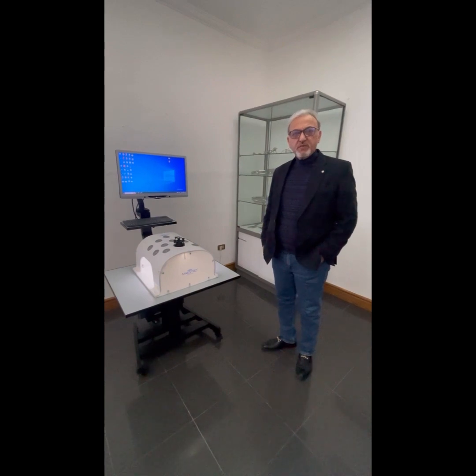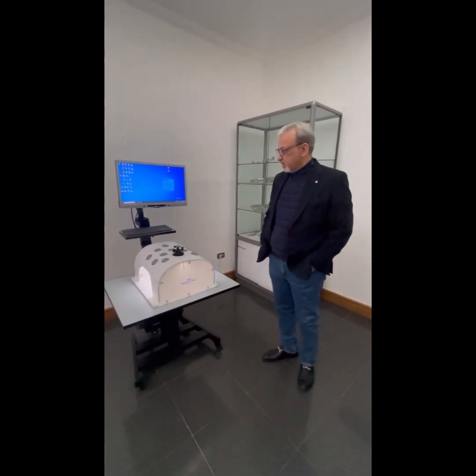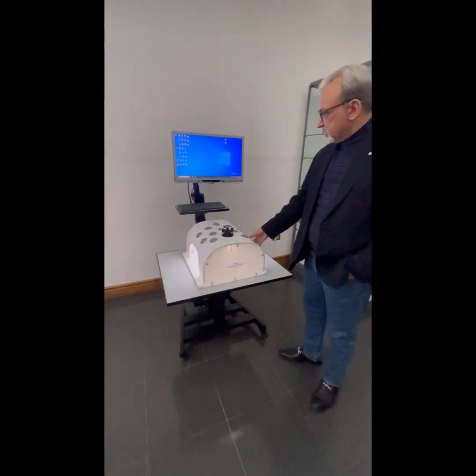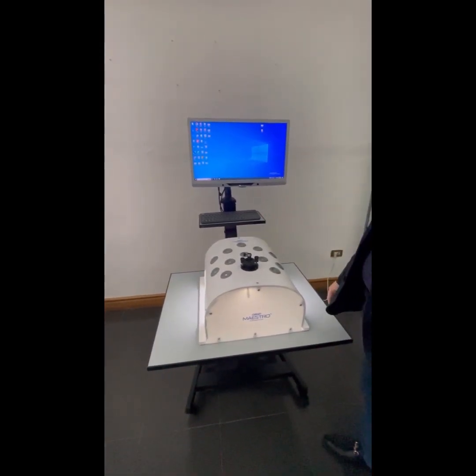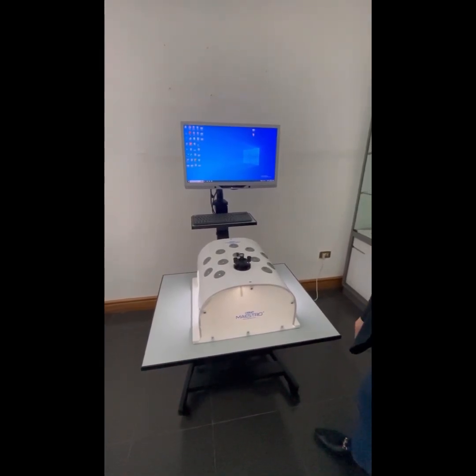I am Akhil Abbas from JRT Healthcare and we are proud to present our laparoscopic training system, which comprises a laparoscopic training box, a trolley, LCD, keyboard and CPU. I will explain to you one by one all these components that make our Maestro training system.